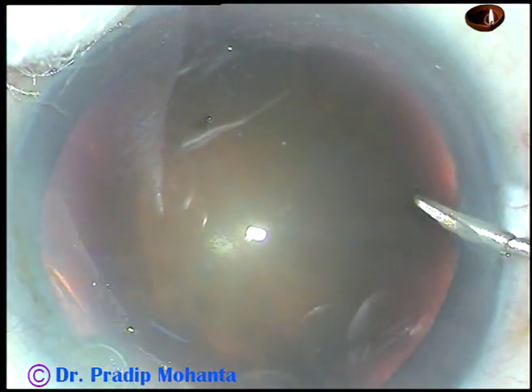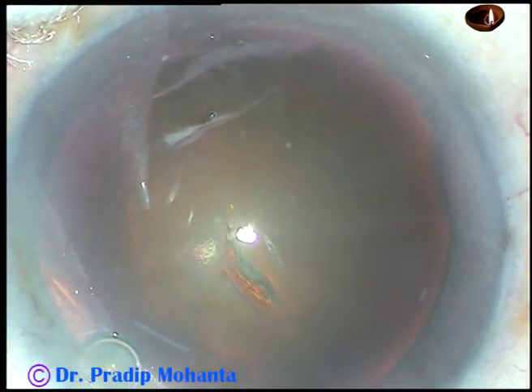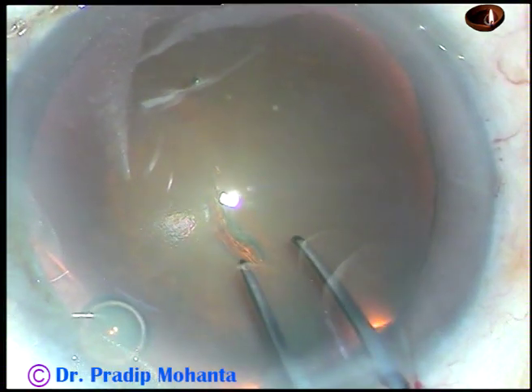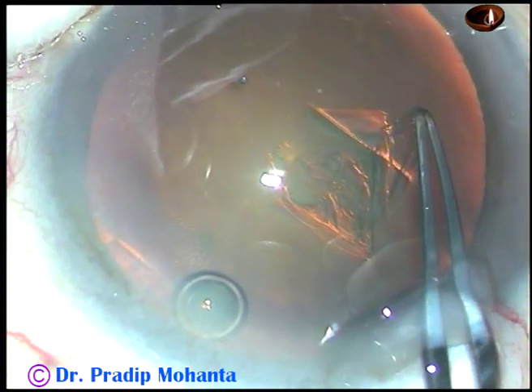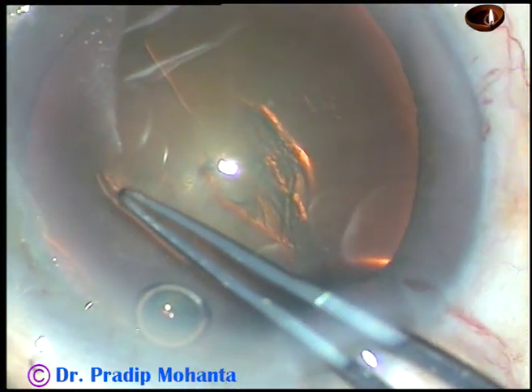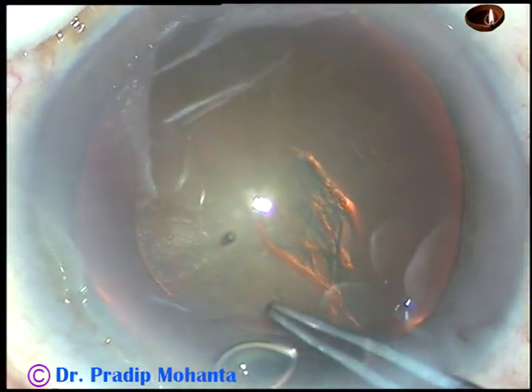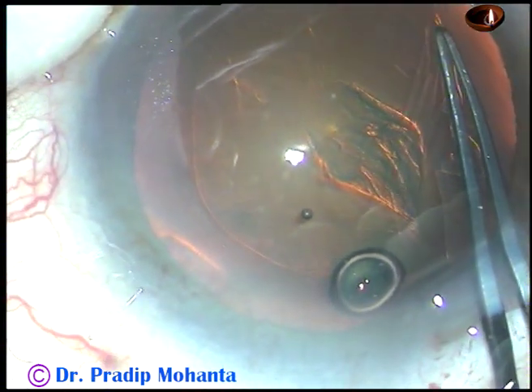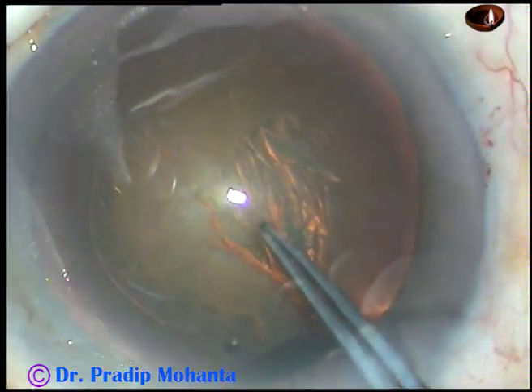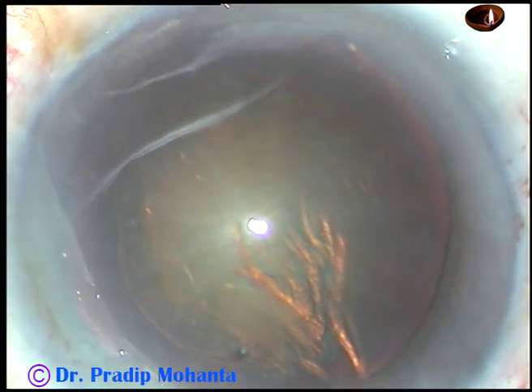And now capsulorhexis — the anterior capsule is incised with a 26-gauge needle and a capsular tag is raised. I hold this tag with a Utrata forceps, go anticlockwise, and try to remain at a certain distance away from the margin of the pupil. And thus, in most cases, I managed to get a round rhexis.